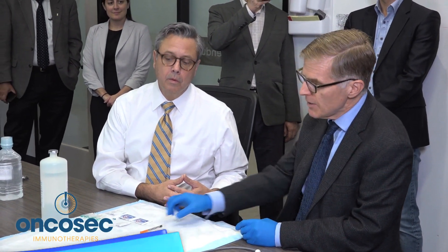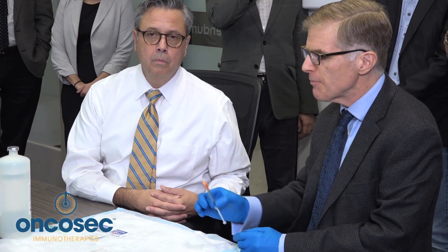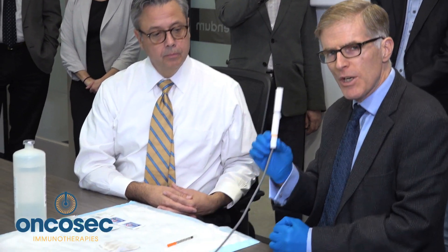The process of using IL-12 with electroporation is pretty straightforward. We have a simple syringe, which has been filled by the pharmacist with the right amount of medicine for the patient's tumor and numbered for the tumor. You simply insert this into the tumor directly and inject the fluid.